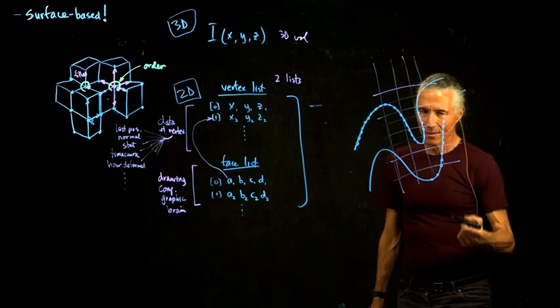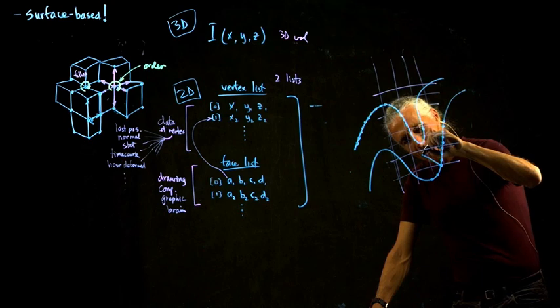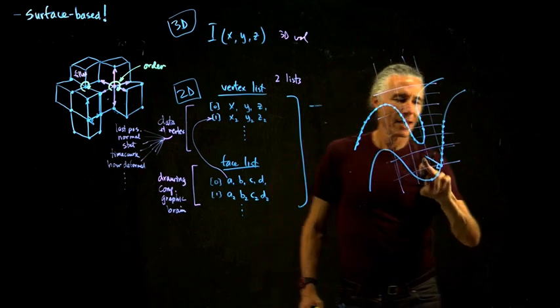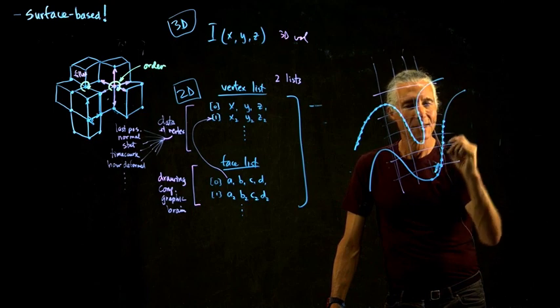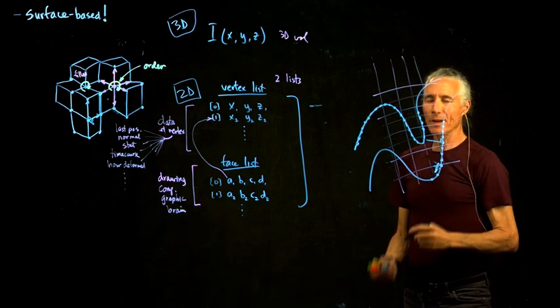Here's one way of getting the data on there. We find the surface normal. So this is perpendicular to the gray-white matter surface.